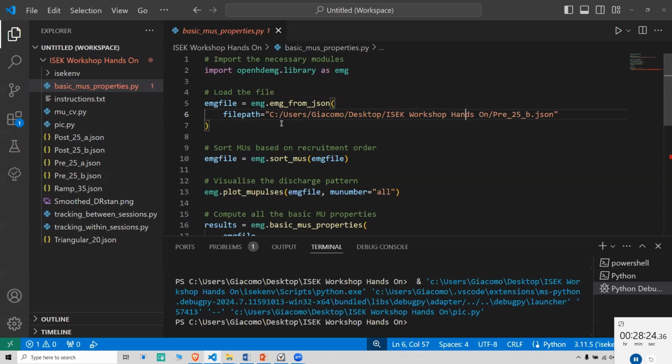If you don't know what importing a library means, what a function means, so if you essentially don't know Python or even coding at all, we have a YouTube channel, and we also did some introductory coding classes that you can use to learn the basics that are needed to use openhdmg, but in general to use Python for data analysis.